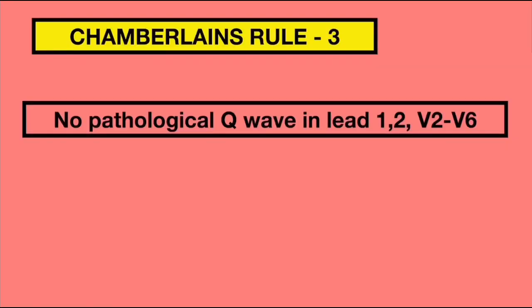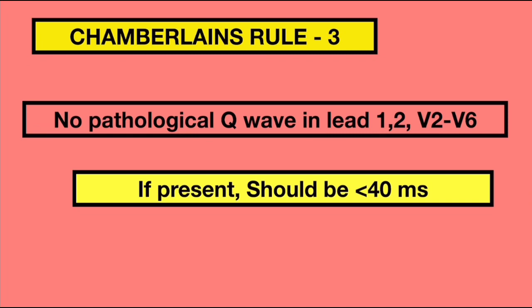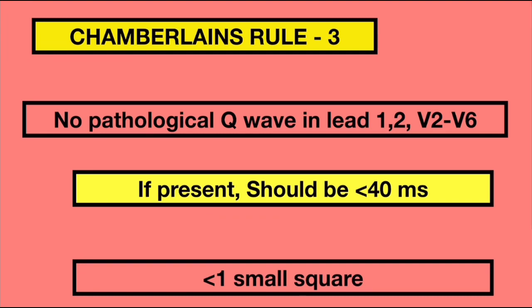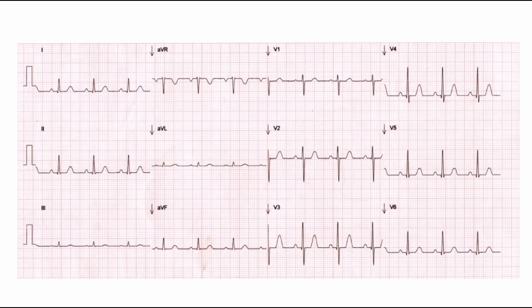Rule 3 says that there should be no pathological Q waves in leads 1, 2, and V2 to V6. If present, it should be less than 40 ms. Q waves are considered pathological if they are more than 40 ms in width, more than 2 mm in depth, or more than one-fourth of the height of the QRS complex. In this ECG, we can see that all Q waves are less than 40 ms in duration and the height is also not suggestive of pathological.